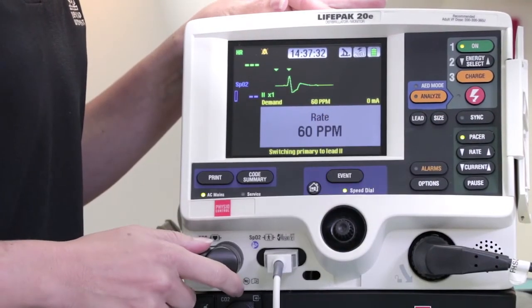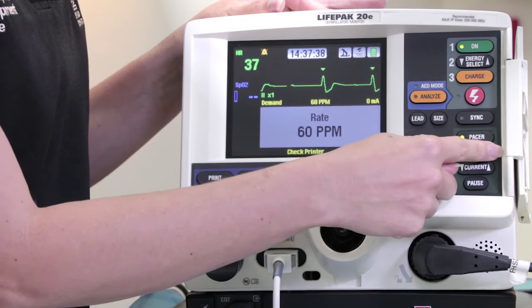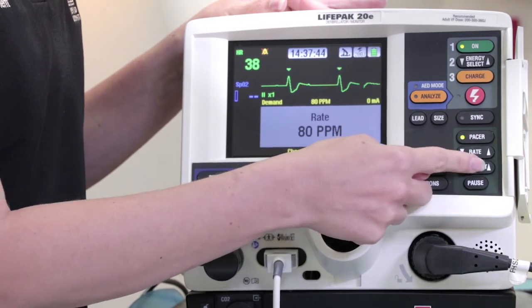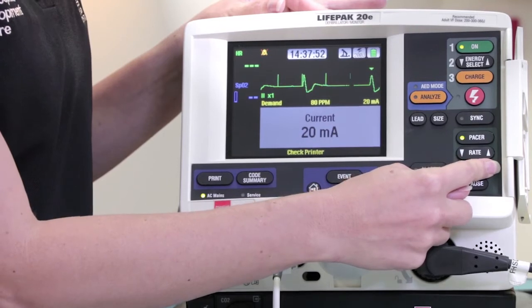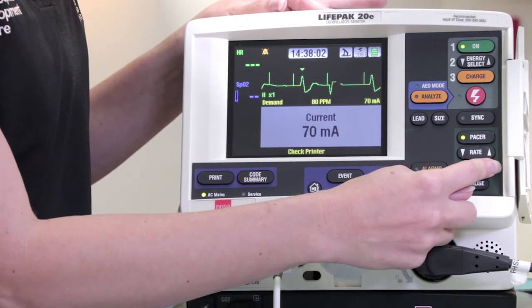Once attached, turn the pacer button on and set an appropriate pacing rate using the rate button — this will usually be between 60 to 100. Next, we will set the current. Adjust current up from 0 milliamps until electrical capture is observed on the monitor, which is generally 50 to 120 milliamps and should achieve capture on most adult patients.